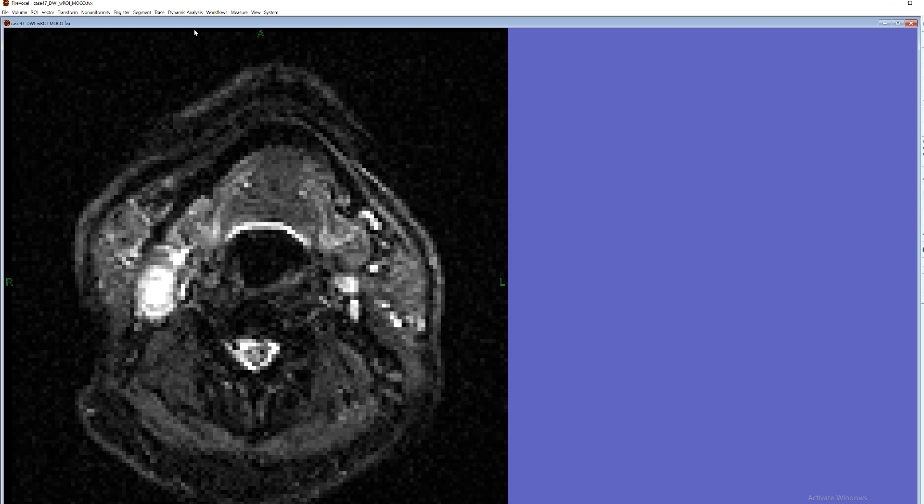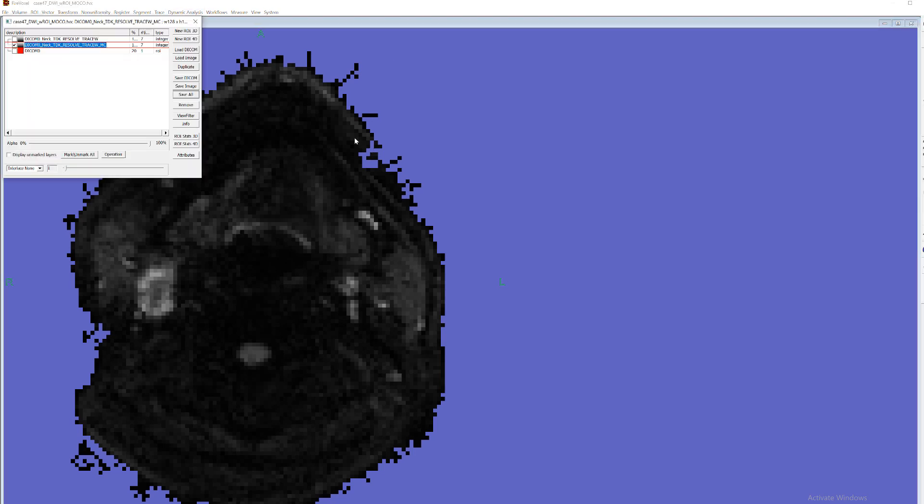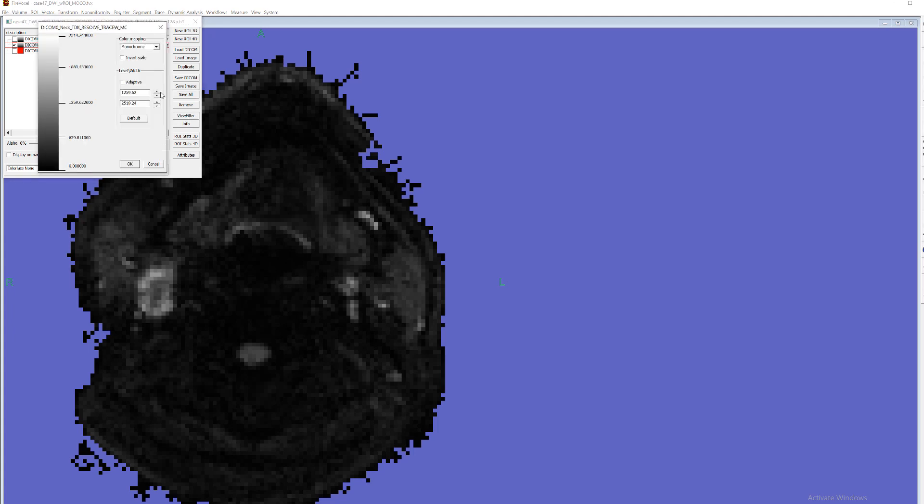And this is because there is a single mapping that converts from image signal intensity to screen intensities. So if you go to layer control dialog box and choose a layer and then press view filter.